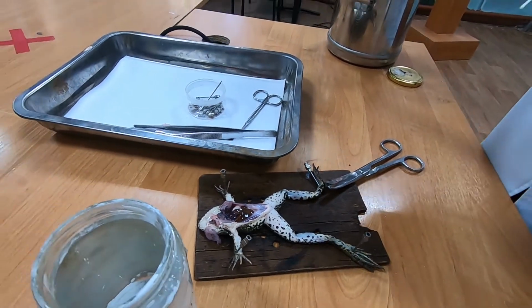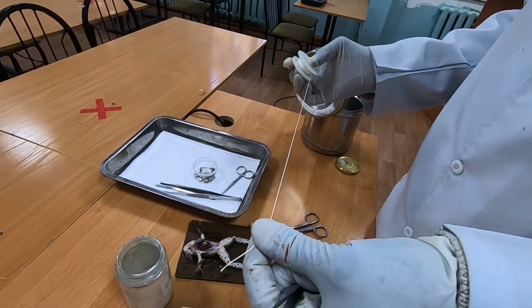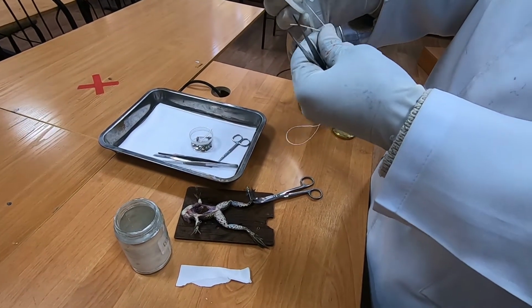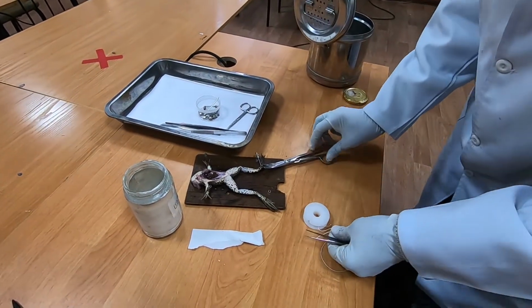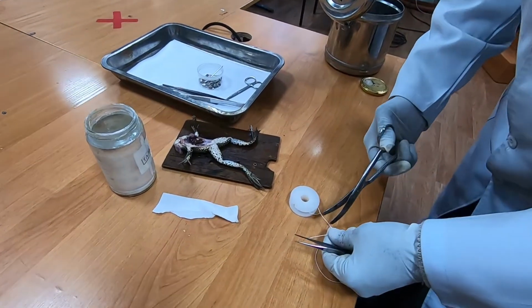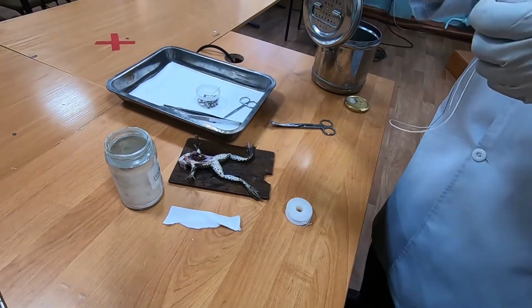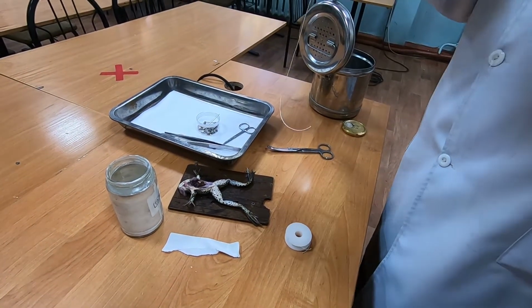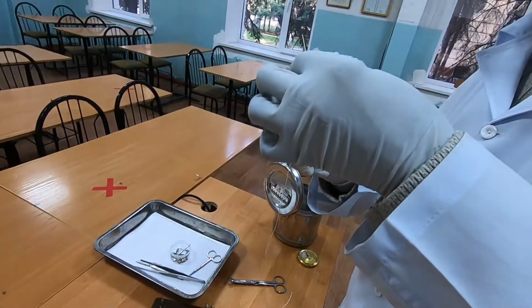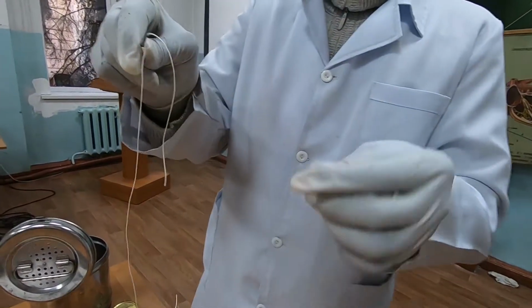We are going to use what we call the ligature thread, to allow us to take a grip. So we take one end of the thread.